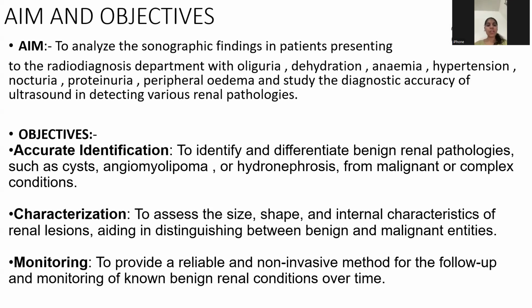Once we have found the diagnosis of the patient and fit him into the appropriate renal pathology, we need to provide a reliable and non-invasive method for the follow-up and monitoring of these benign renal lesions over time so that we can prevent them from turning into a malignancy.